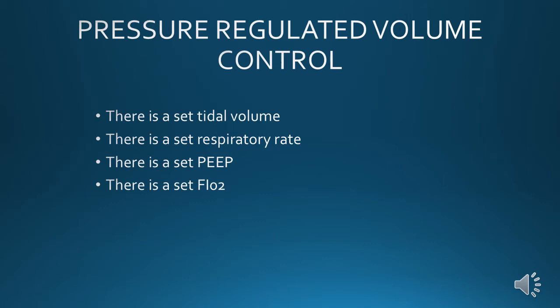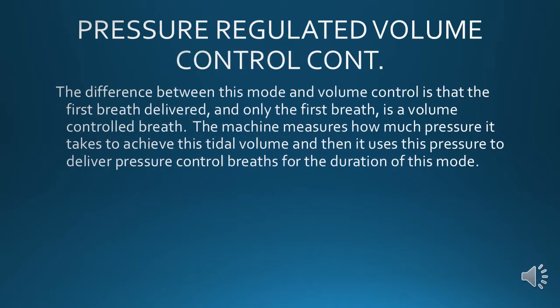Now, if we set a certain pressure to get a tidal volume and we walk out of that room, how long is that setting really good for? Compliance changes and resistance changes happen constantly in our lungs. And so that setting you put in may not be very good for very long. So here is the big difference with PRVC. In PRVC, as we said before, you're going to set a certain tidal volume.